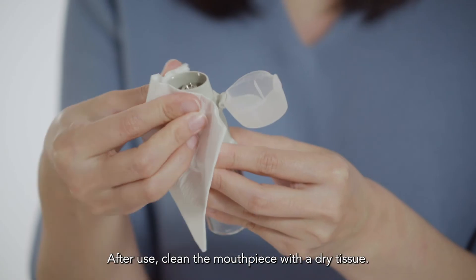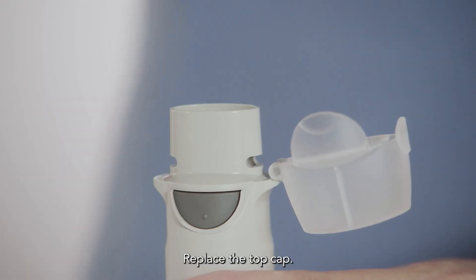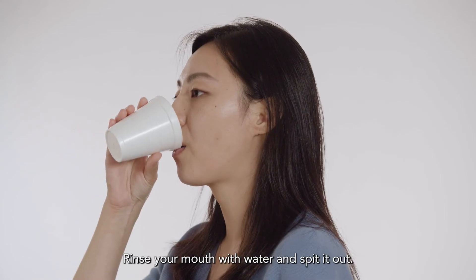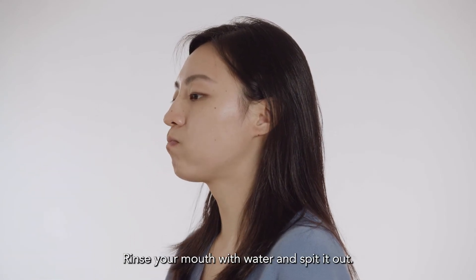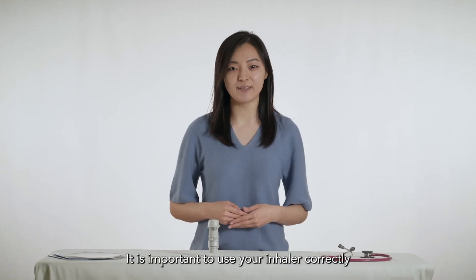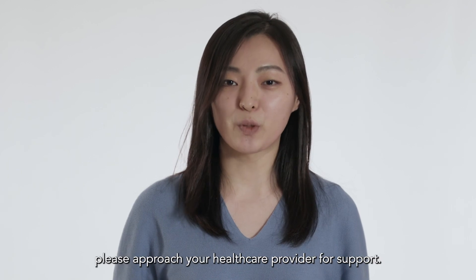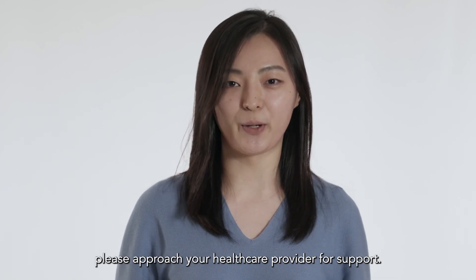After use, clean the mouthpiece with a dry tissue. Replace the top cap. Rinse your mouth with water and spit it out. It is important to use your inhaler correctly and as prescribed for your condition. If you still have questions regarding your inhaler technique, please approach your healthcare provider for support.